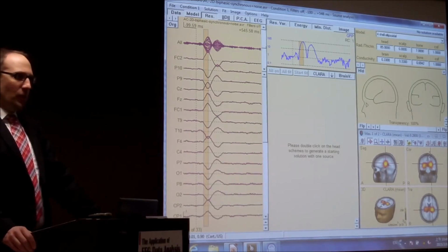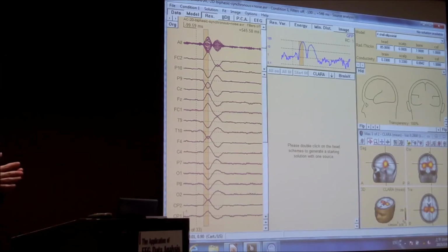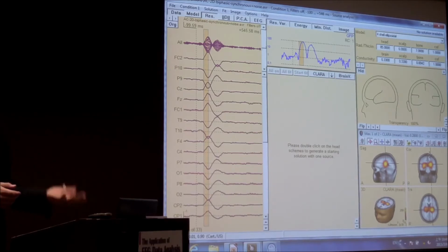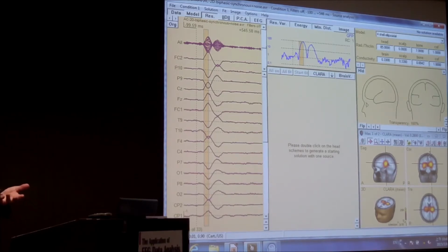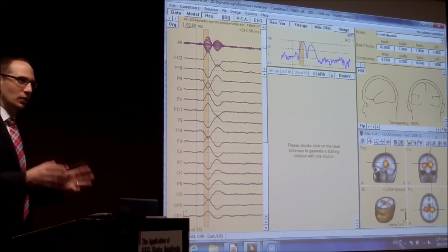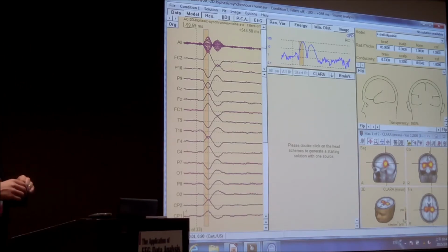There is a big danger about distributed sources. People sometimes think that one method is suitable for everything. That's not right. Someone was sitting down and developing a method because he had a very special research interest, a special topic he was looking at, and designed a method around that. And yes, you can use this method very well for similar examples. But if you do another experiment, this method may completely fail. And then it's a little misleading.